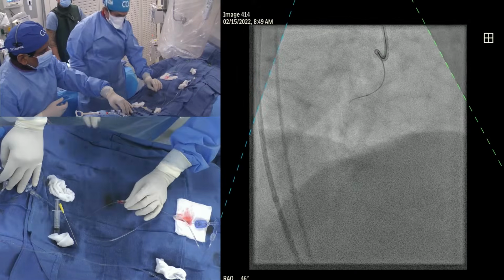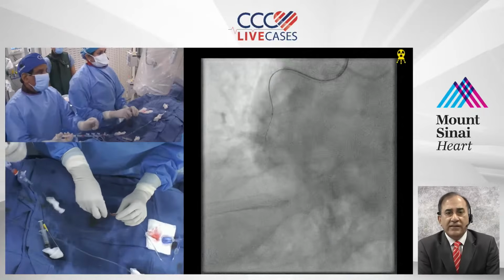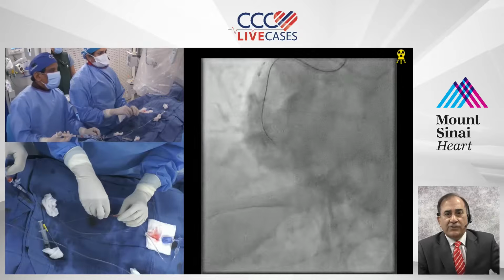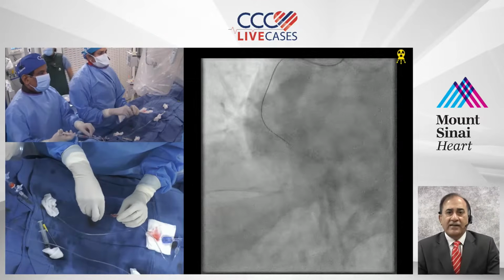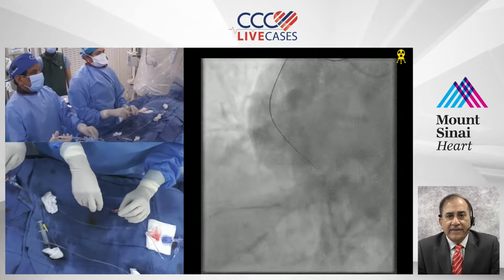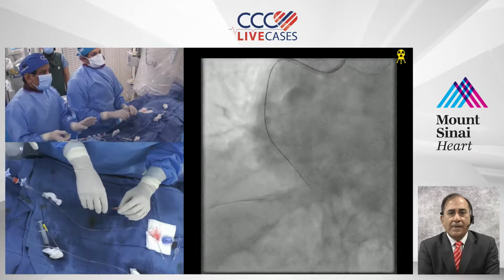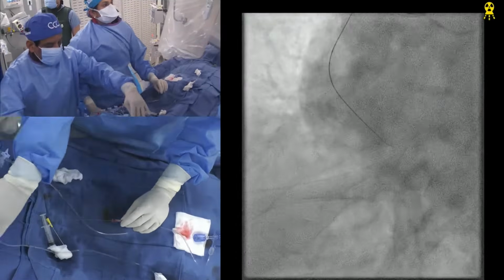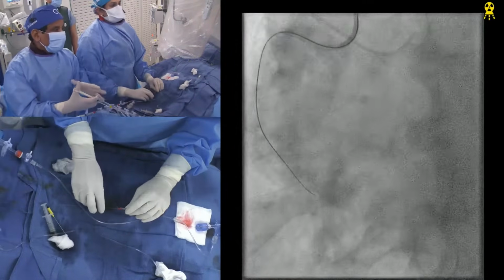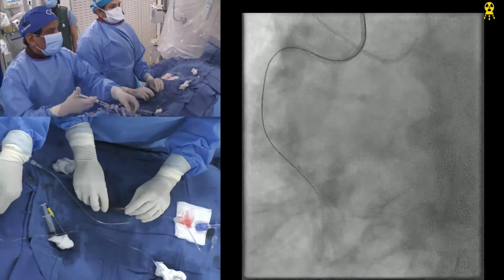But the real implications of BASKET-SMALL 2 are wide-reaching. As you were showing it, I kept thinking we seem to have made a lot of progress there. Right or wrong, we have to see. At least they should have used a biolimus-eluting stent, which is polymer free. They should have compared with that.